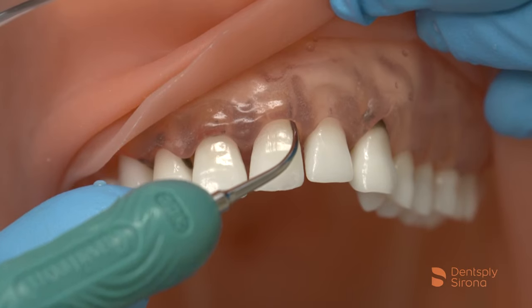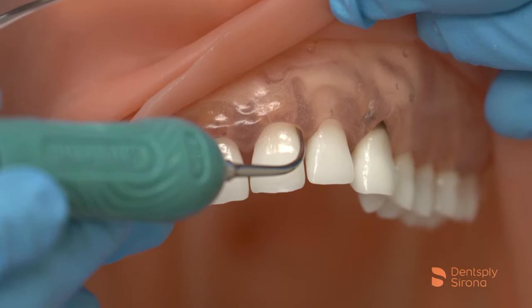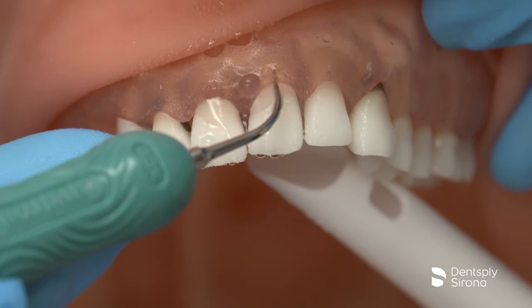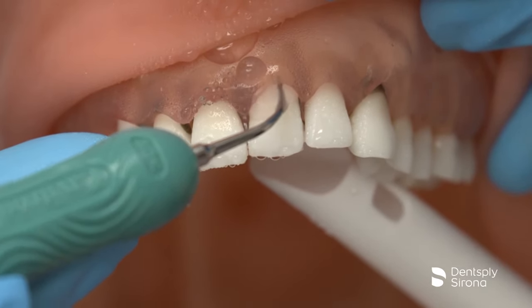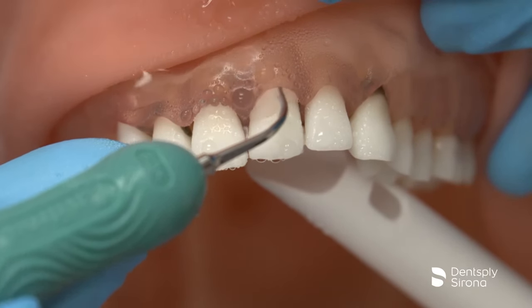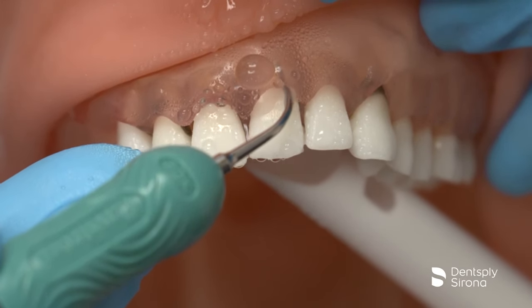As the clinician enters the sulcus, it is essential to assess the anatomy as the insert travels to the base of the pocket. If calculus is encountered, the clinician engages the terminal end of the deposit in a light tapping approach, followed by small sweeping strokes to provide lavage and assess the removal. It is imperative to ensure complete removal by producing a stroke pattern that is overlapping and methodical.